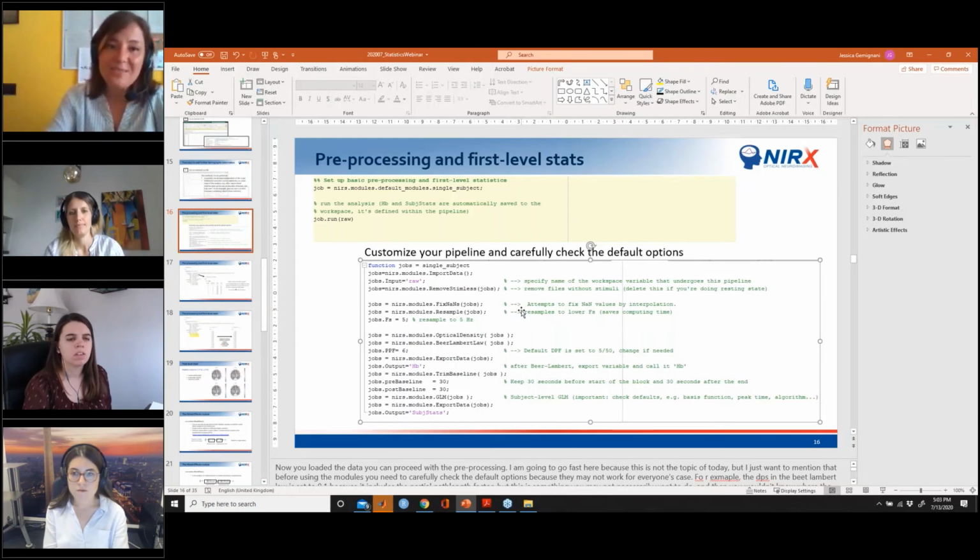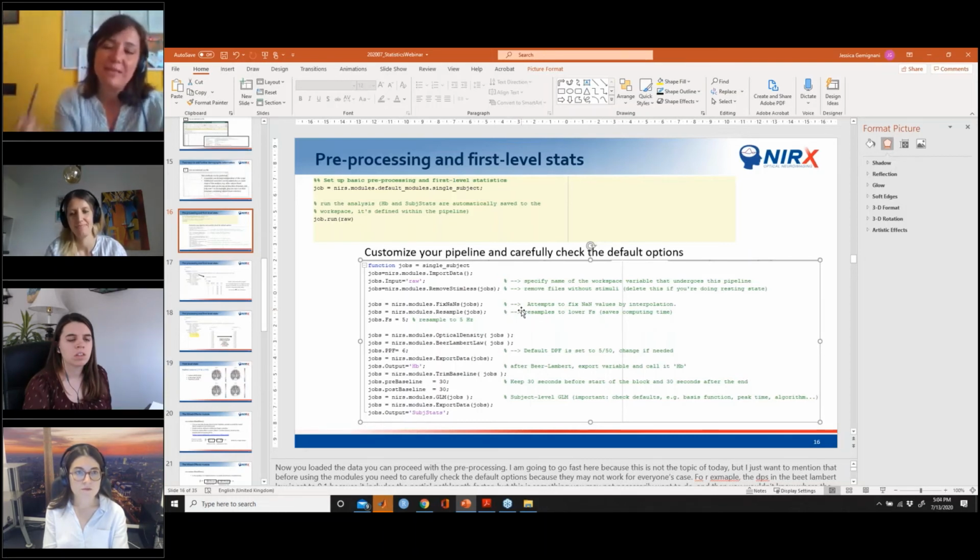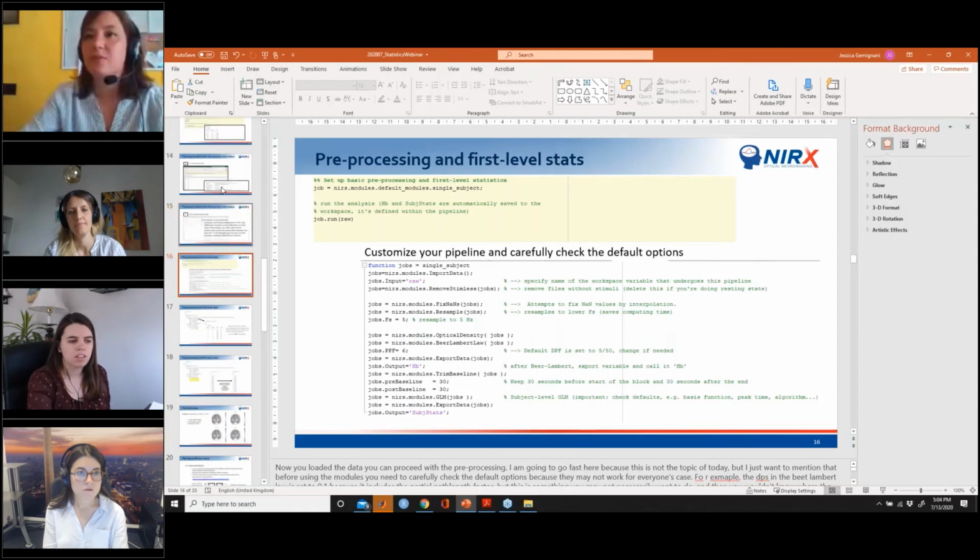But if the user was referring instead to using... at some point, it's my doing actually, because I made this slide, ANOVA versus mixed effects. So I think this actually warrants a clarification. So when I made this slide, let me go there, on the ANOVA versus mixed effects. Let me see if I find it.